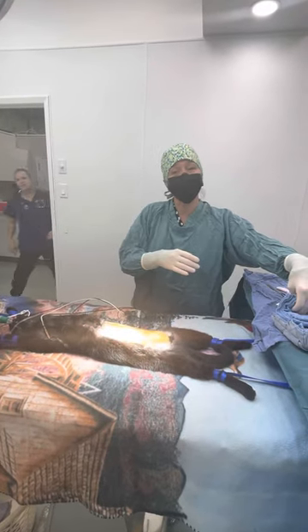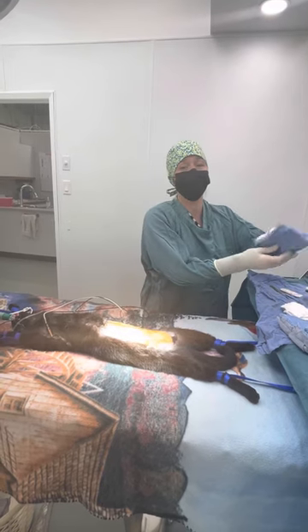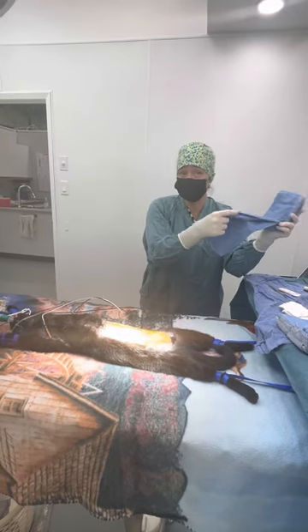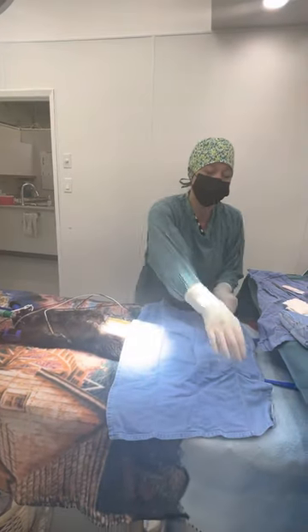Hi everybody! I'm going to do a video today of a spay surgery on this cat. Her name is Willow. She is a young six-month-old cat and her spay surgery should feel fairly routine.